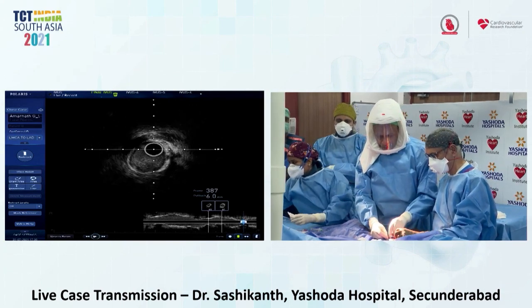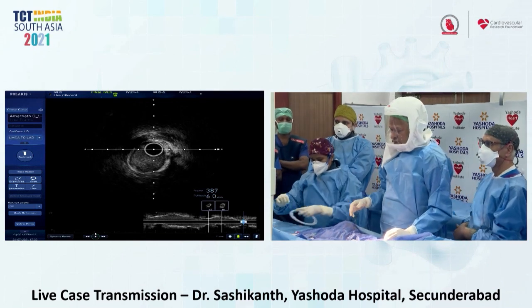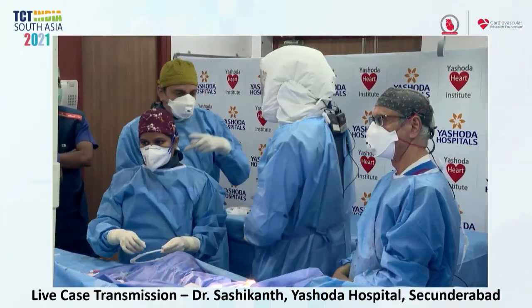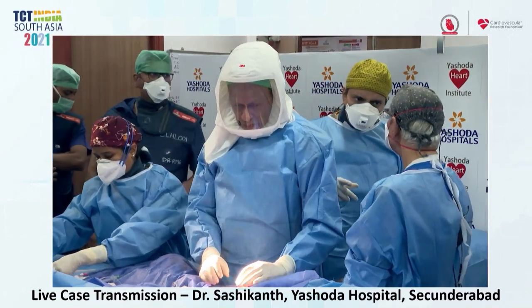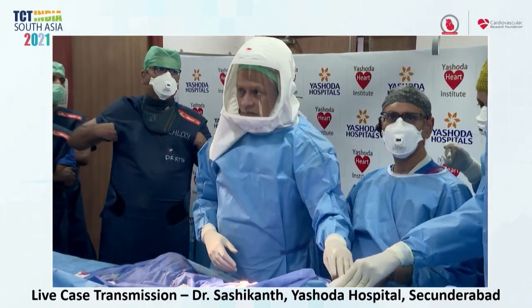Thank you. Also from my point of view, congratulations on this demonstration. I think in this case it was really a zero contrast dose. But as AJ mentioned, safety first, and if you're in doubt, please you can even use some amount.